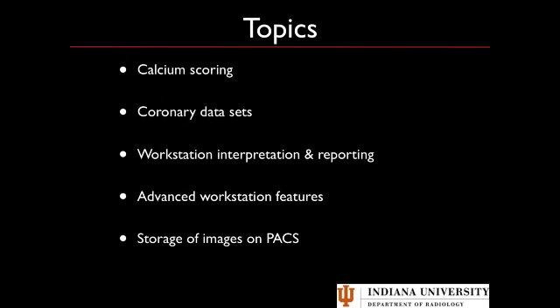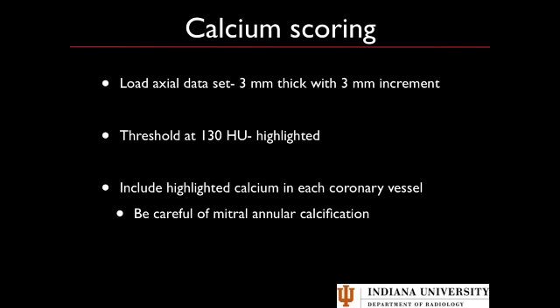We're going to talk about calcium scoring. We're going to talk about doing coronary CTA. We're going to talk a little bit briefly about the interpretive and reporting process using a workstation. We'll briefly talk about some advanced workstation post-processing features, and finally mention just briefly about storage of the image data sets on PACS. So let's move into calcium scoring.